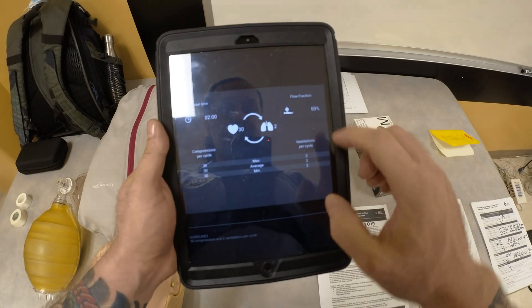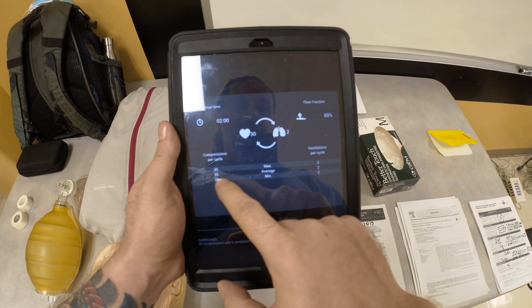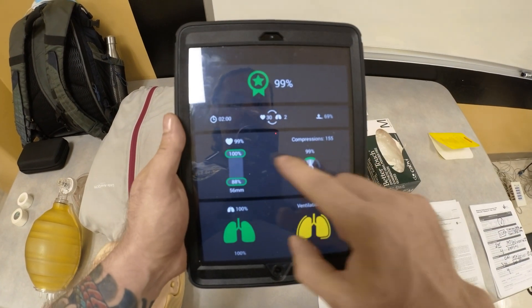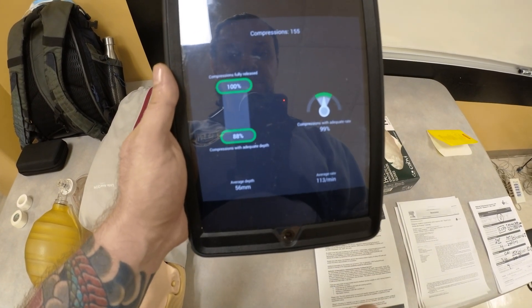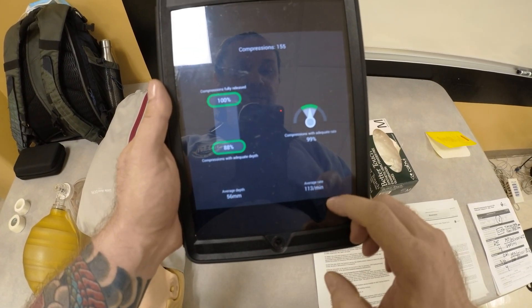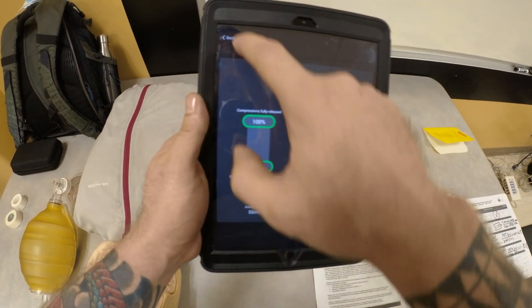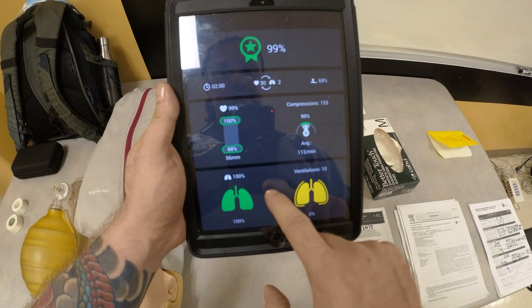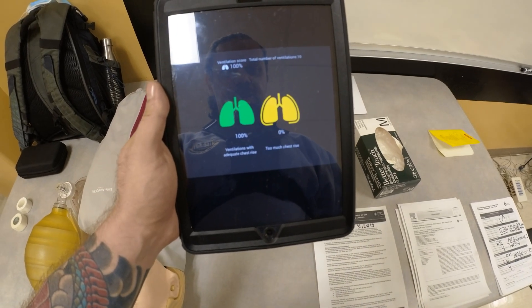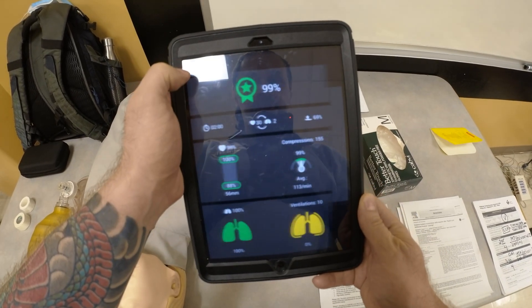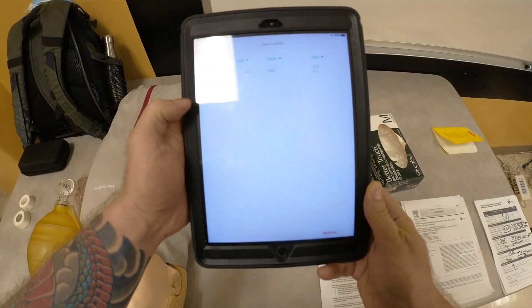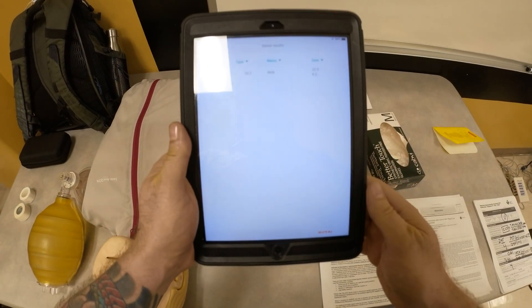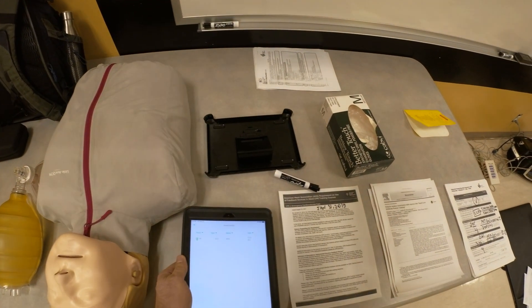It will tell you total time, compression per cycle, flow fraction — which is chest compression fraction — compression depth of 56 millimeters, your average rate, and total compressions performed. The bottom portion will have your ventilations. This is how you would employ this app to objectively evaluate your students whenever you're conducting these stations.